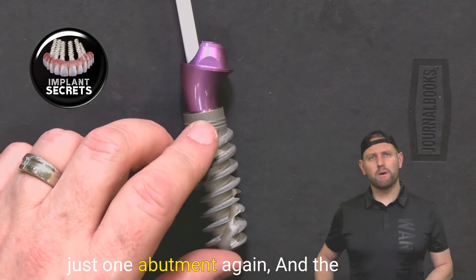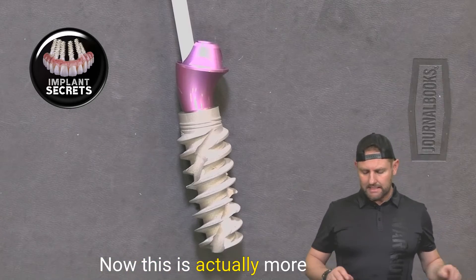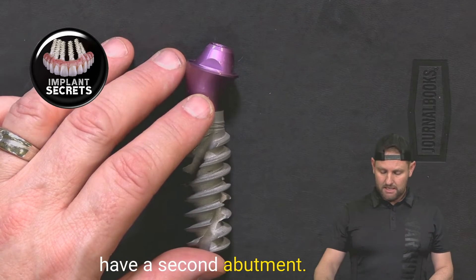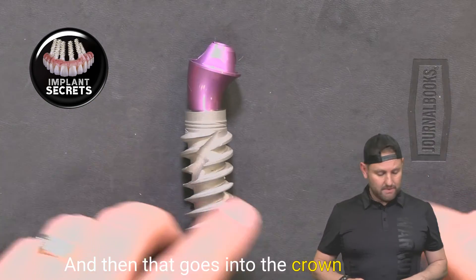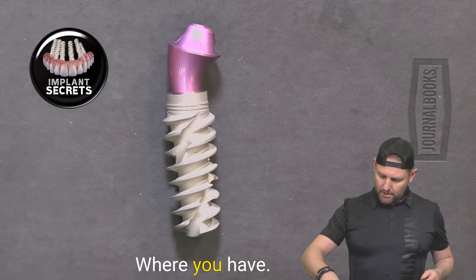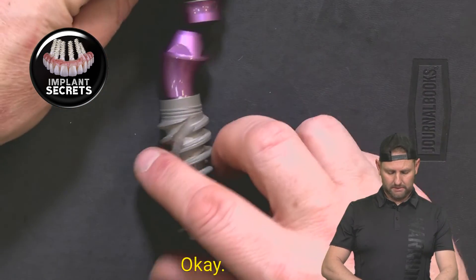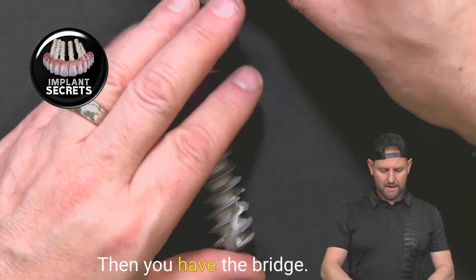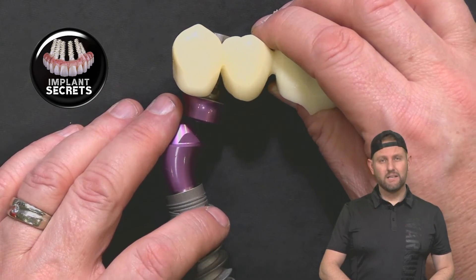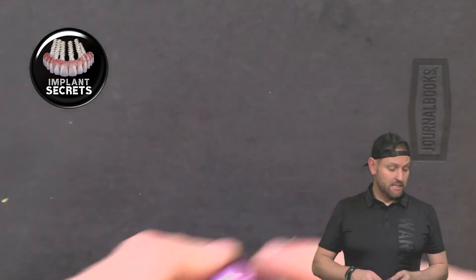We call it multi because instead of having just one abutment — implant, abutment, and crown — this is more complex. We have an implant, one abutment, and then a second abutment that goes on top of that first abutment, and then that goes into the crown. Imagine one abutment going on top of another, and then the bridge on top of that. Multi-unit means two units, with a bridge on top. Most of the time when you do multi-units, we're using bridges — I can't think of a scenario where you'd use a multi-unit without a bridge.